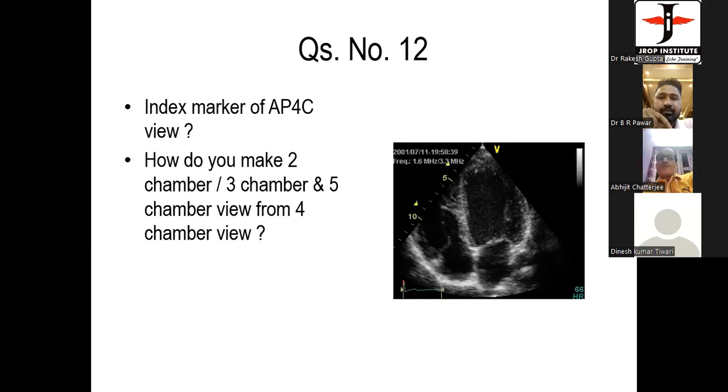Suppose I don't want to do the modified Simpson method. Is there any other way of assessing the right atrium? No, sir, I don't know. Don't worry. Sir, can I have the next person, please?